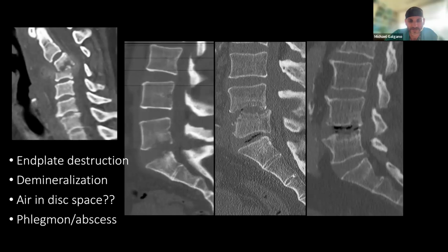If they have a pathologic fracture and their neurological exam is very out of proportion, because when you first showed that CT scan I'm saying this really doesn't look all that bad. It looks like an osteoporotic compression deformity, and then they've got a 6-level epidural abscess, and that's why they're going paralyzed. So this is why it's important to examine patients, you know?